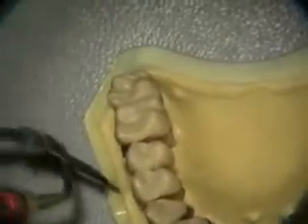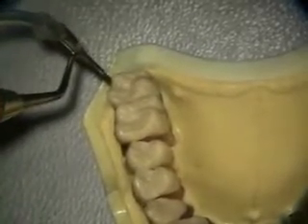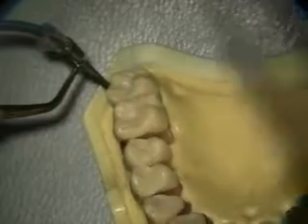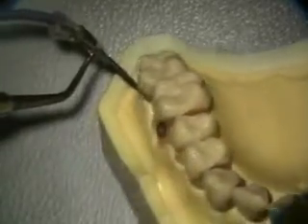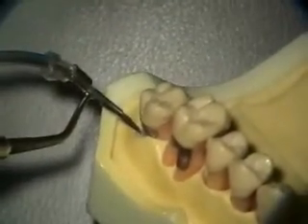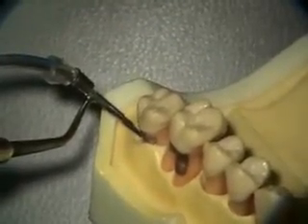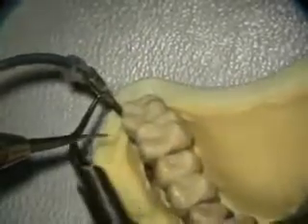I normally have to push the cheek up and out of the way and push the explorer right into the distal buccal corner of the second molar. But I don't really have to see it, I just feel it, and then I get the ultrasonic in there.